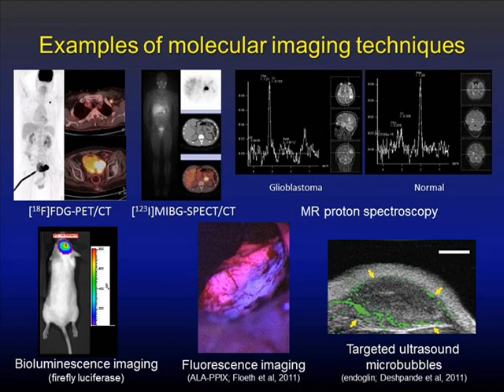It's a type of neuroendocrine tumor that actually makes hormones, and to make hormones, it actually takes up precursors, and we can see that with MIBG and see where that pheochromocytoma is. There's actually also treatments you can do for this. If you change your isotope from I-123, which is a way to see things with SPECT, to I-131, which is a damaging radionuclide, you can actually both see it and potentially treat it with the same drug.